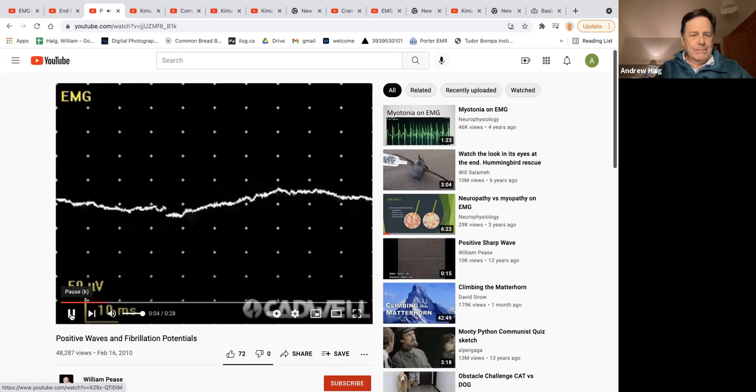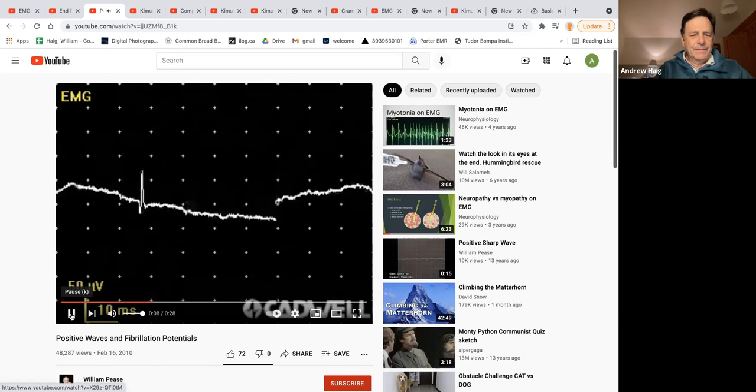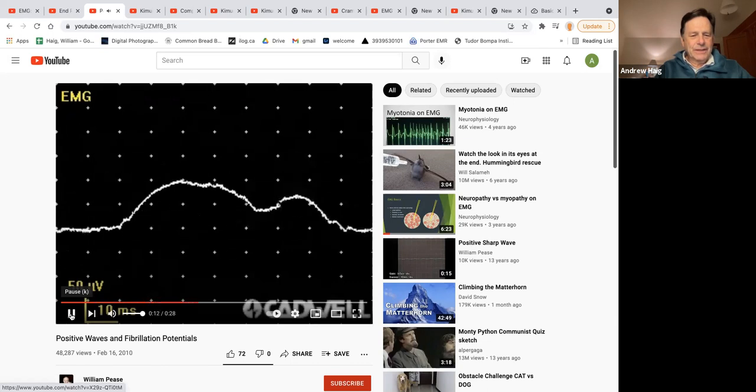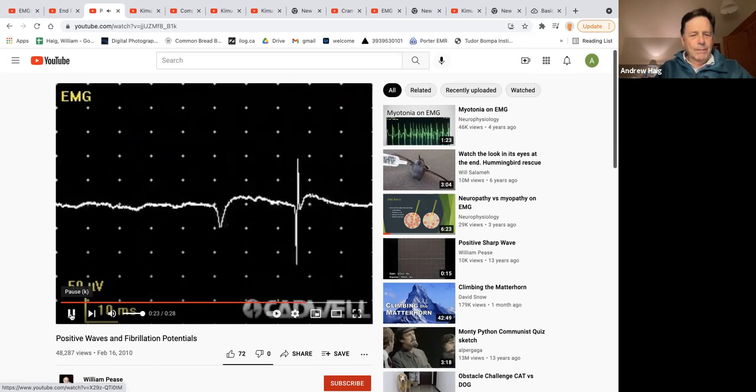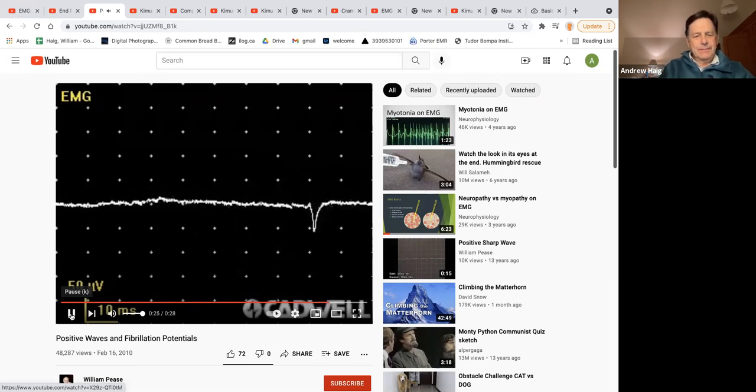Pop, pop, pop, pop, like rain on the roof. That's a fib. There it goes. Now let's hear a positive wave. See that kick when it's in the background? So that sharp thing's a fib. The thing rumbling in the background, boom, boom, boom, is a positive wave. You see they both go down before they go up.